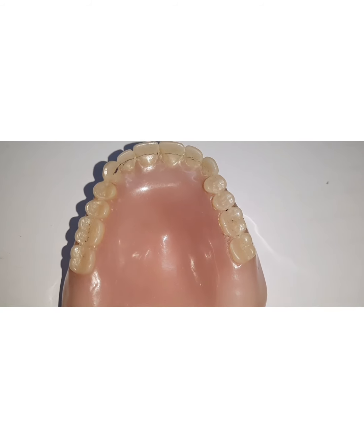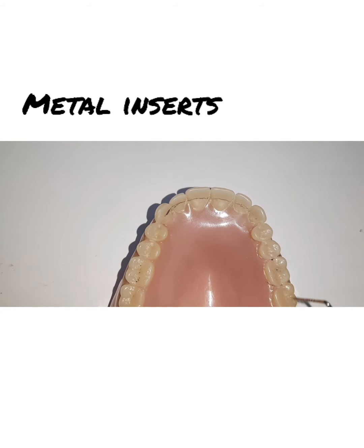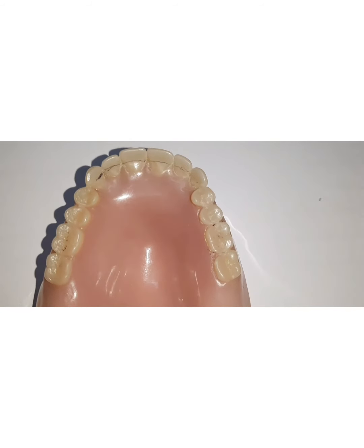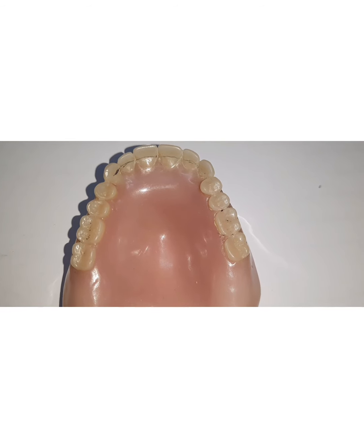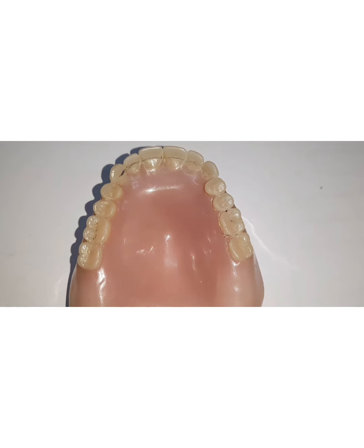Apart from this, metal inserts can also be used. You just create a hole here. You can place those Vitalium metal inserts so that they have better wear resistance than acrylic resin, especially in the posterior teeth. Apart from this, IPN resin is also used for fabricating the denture teeth.